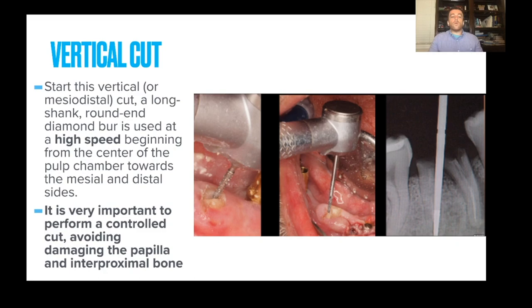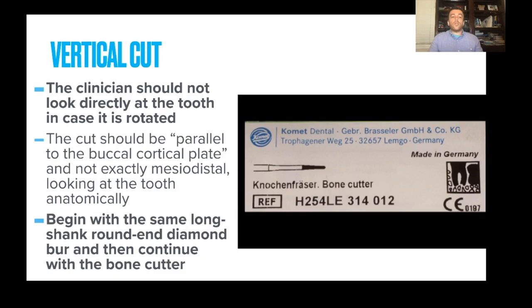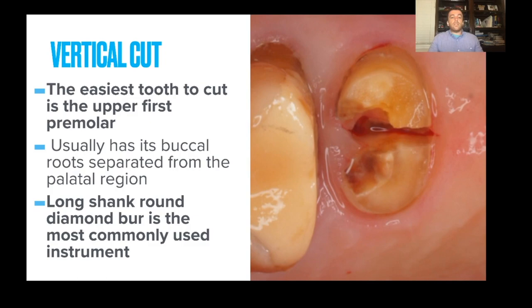Perform the vertical cut in a controlled manner, avoiding damage to any papilla or interproximal bone. The clinician should look directly at the tooth in case it's rotated — the cut should be parallel to the buccal cortical plate and not exactly mesiodistal, because every tooth has a different anatomy. Continue with the bone cutter burr after the long shank round diamond. One of the easiest teeth to cut is the upper first premolar, naturally because it has buccal and palatal roots separating from each other.